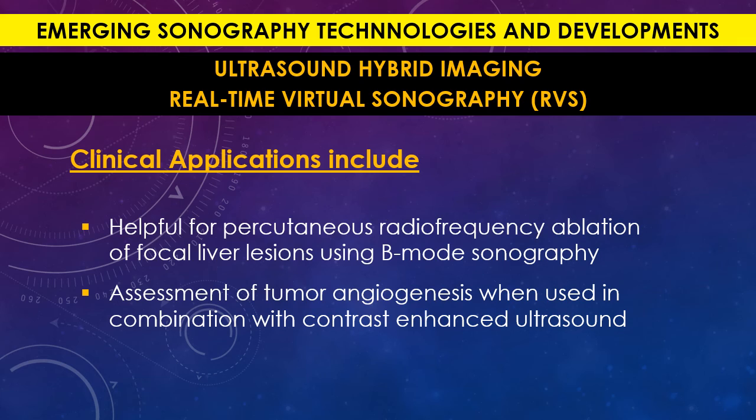The second thing is that it will also help in the assessment of angiogenesis. Angiogenesis is simply how much vascularity the tumor has. For example, if you have a CT or MRI that is showing some angiogenesis or more vascularity, this can be emphasized also with the use of contrast ultrasonography or contrast-enhanced ultrasound, at the same time that the machine displays the angiogenesis features in the CT or MRI. So this will also improve the diagnosis of angiogenesis or the vascularity of the tumor.